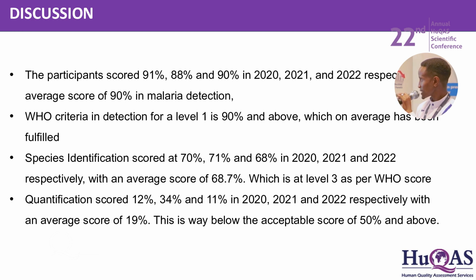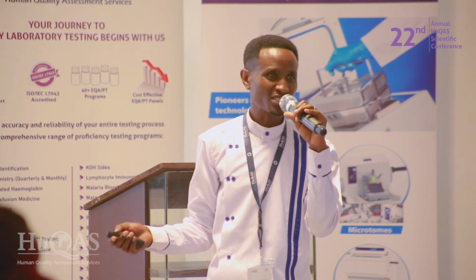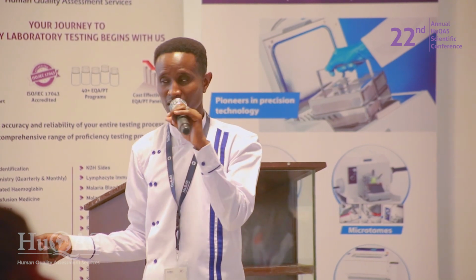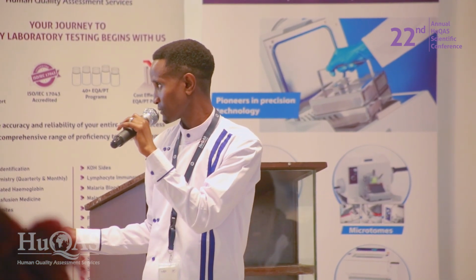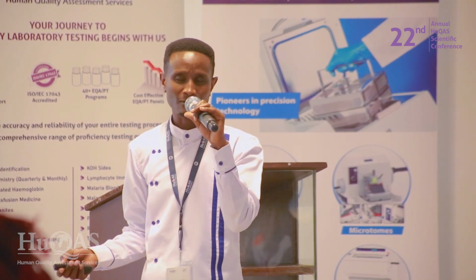Then quantification was the least performed, at an average score of 19%. But the acceptable score is supposed to be 50% for quantification. That's very low, eh? It's like those people who are doing sciences; they have a pass mark of 40%, but those who are doing some other subjects, you get it, eh? So quantification is not easy. That's why the WHO says that to qualify as a level 1, you have to have an average quantification score of 50%.